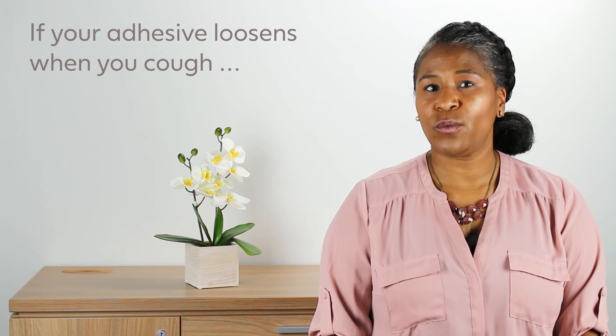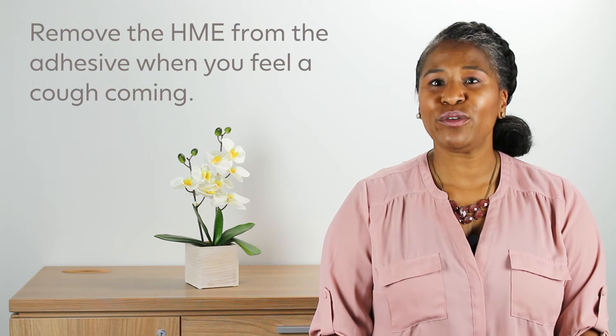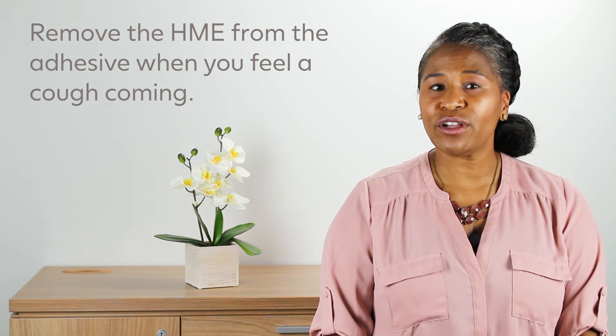If your adhesive is loosening when you cough, remove the HME from the adhesive when you feel a cough coming on. After you cough, carefully remove any mucus from in between the adhesive and your skin.